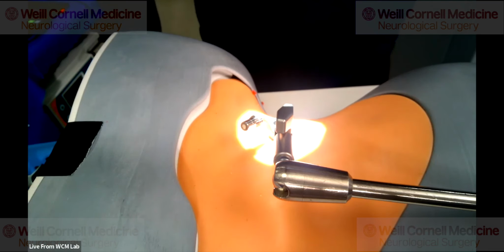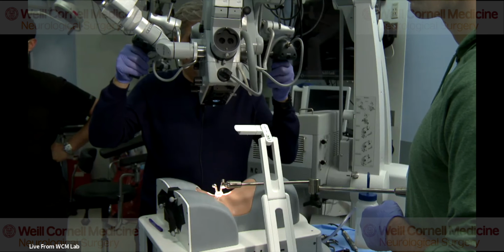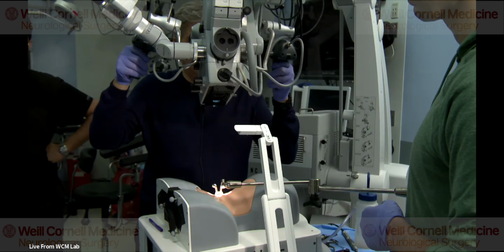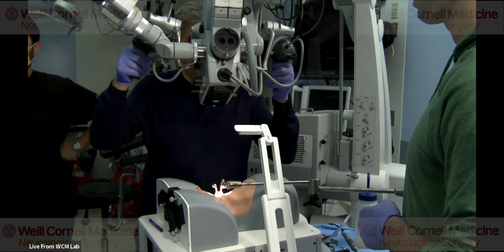With the microscope, you always want to be in a comfortable position. That's what I'm trying to achieve here. Is this in focus? More or less? It's a little soft. Let me know. Okay, you're going further away. Okay, the other way. Good.